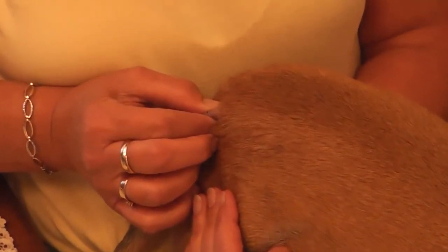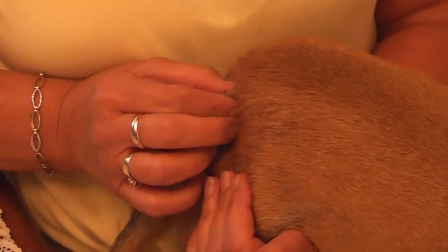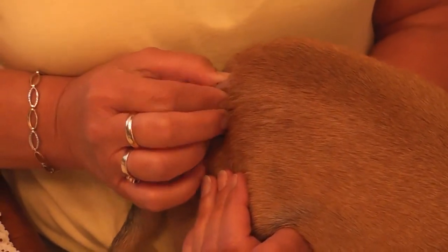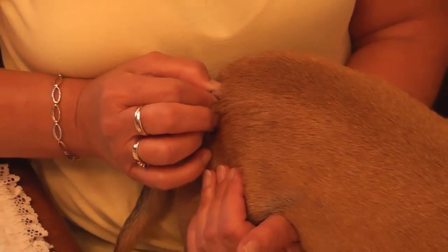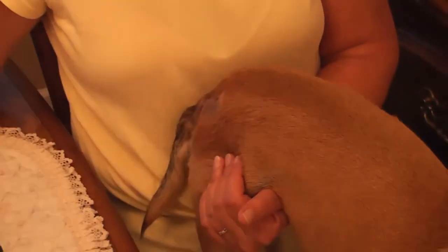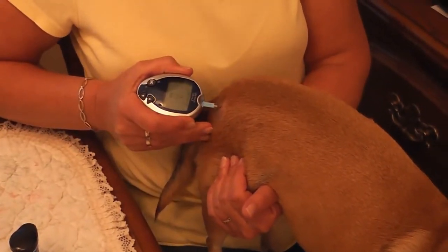Sometimes I have to milk it a little, but don't squeeze too hard — if you squeeze hard, they actually have little sweat glands in their skin, and that will alter your reading. Nice little drop of blood.